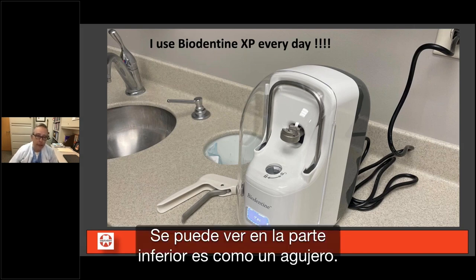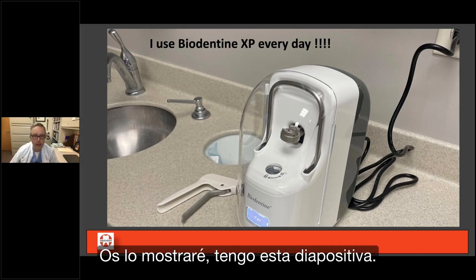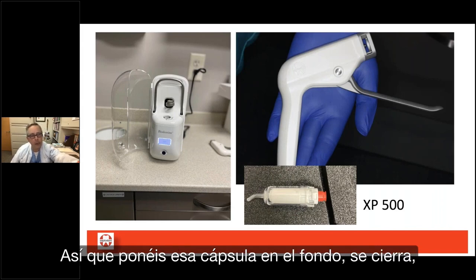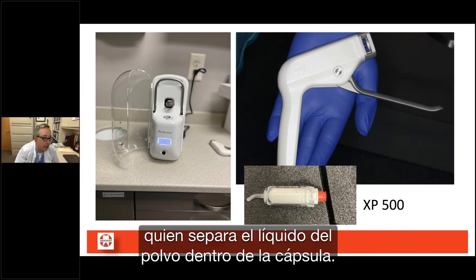You can see at the bottom there is like a hole. You put the capsule there, you close that, you just twist that, and then you move. I will show you. I have the slide. Yes. So you put the capsule. This is an XP 500. So you put that capsule in the bottom, you lock that, and then you see this little metal bar. You push that down, which is basically going to open the membrane that separates the liquid from the powder inside the capsule.